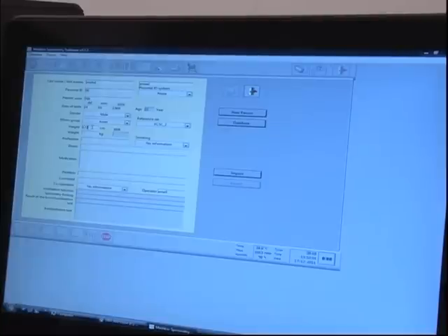height in centimeters, weight in kgs, profession, smoking or not, any illness if any, the medication, the problems, comments, or cooperation if necessary, the ventilation function, spirometry finding, result test and the interpretation text.